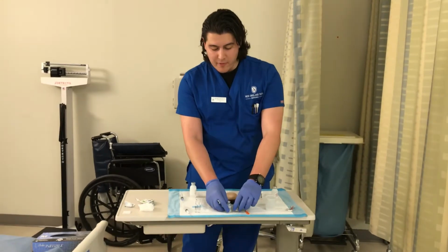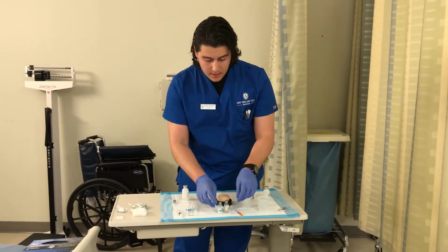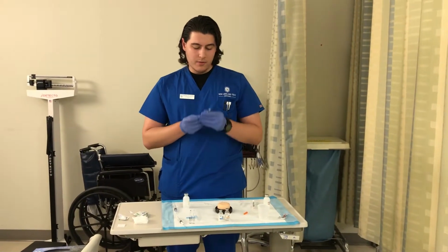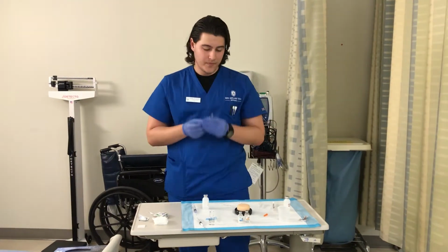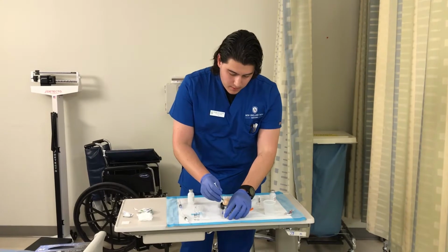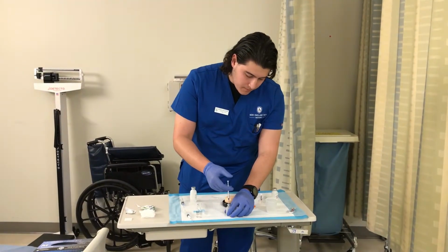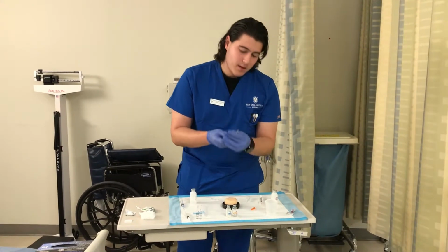With this one, an easy way to remember it is RN. You always want to do the regular insulin first. So I'm going to take my needle here. I'm going to do, say, 10 units with this one. You're going to put the air into the cloudy one first. Put the air in. And we're going to do it again.